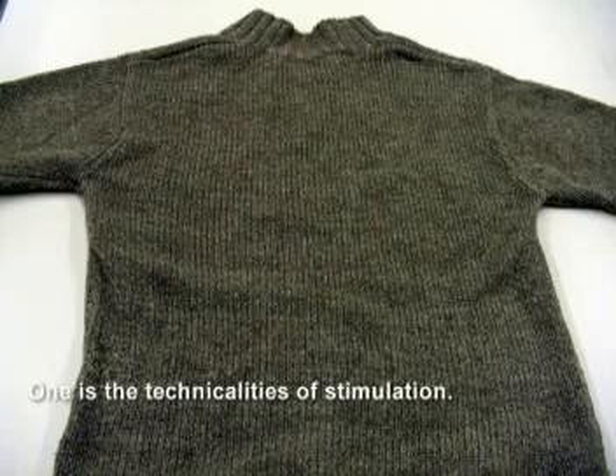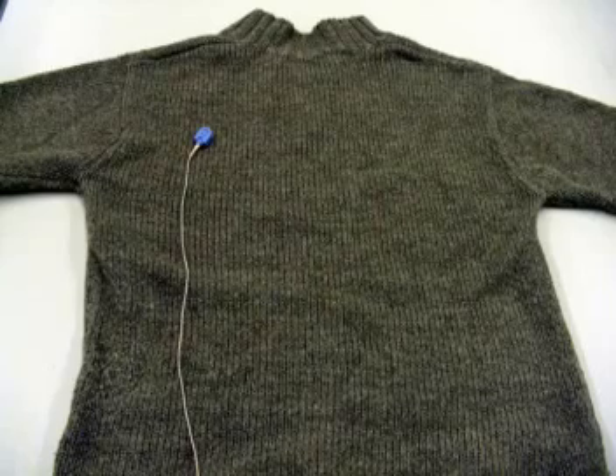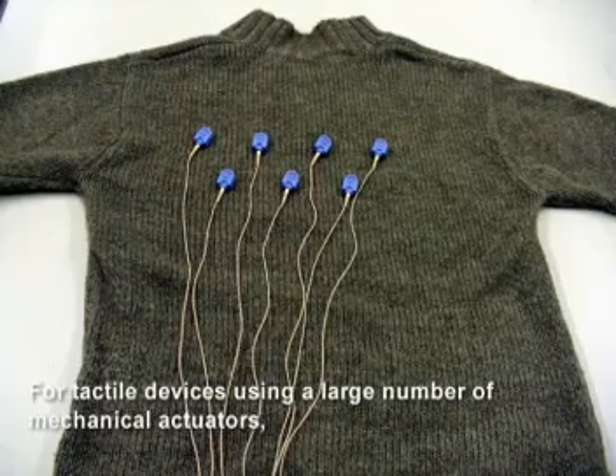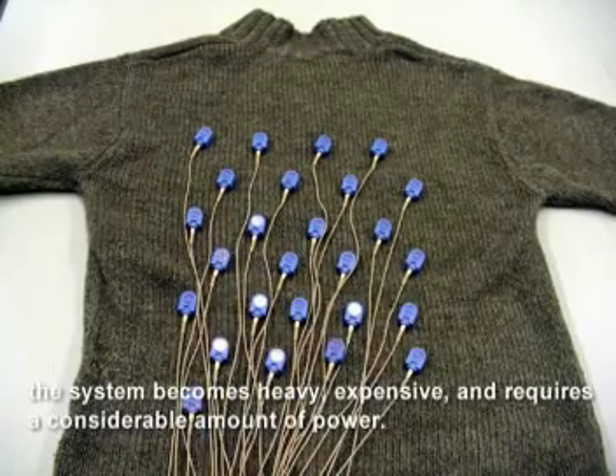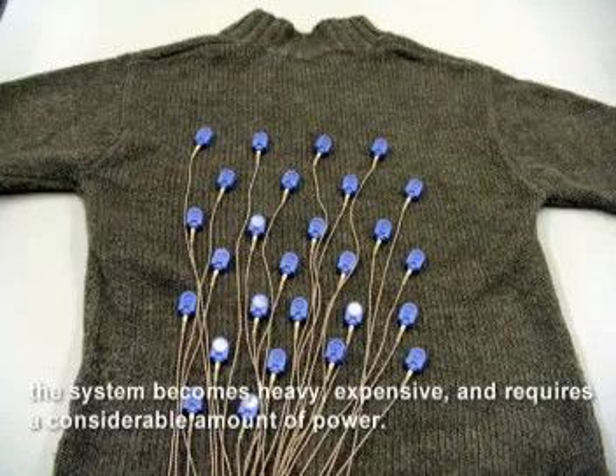One is the technicalities of stimulation. For tactile devices using a large number of mechanical actuators, the system becomes heavy, expensive, and requires a considerable amount of power.